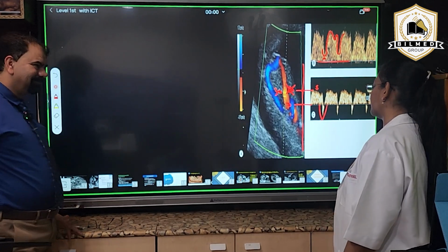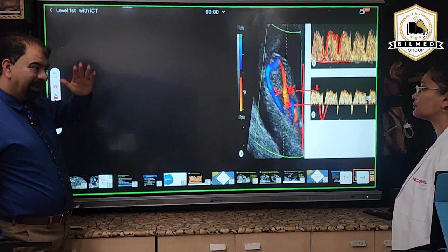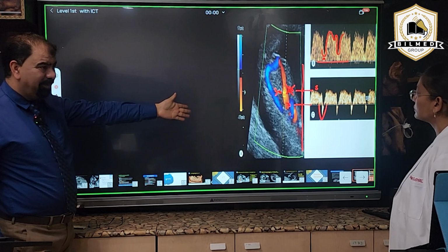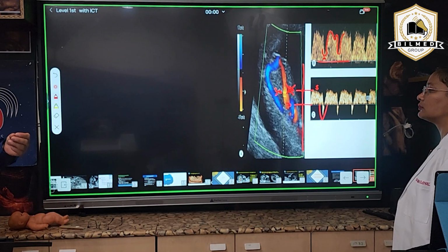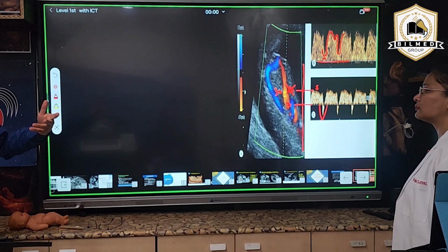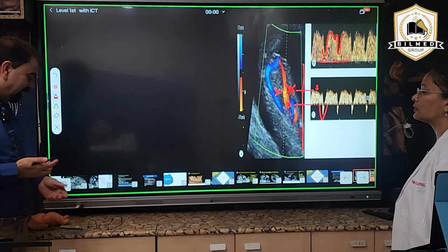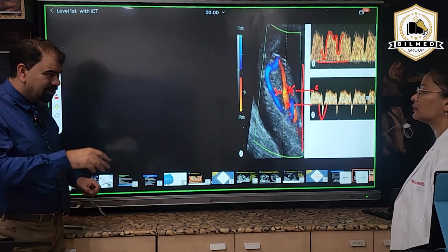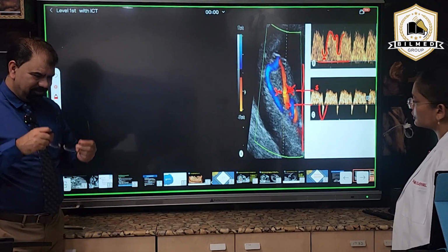Hepatic vein. So this is actually a hepatic vein which is already taken by that doctor for an abnormal ductus venosus. Now, have you not seen cases where it was written that abnormal ductus venosus and rest of vessels were normal? How is that possible? That fetus has landed into acidosis with no signs of hypoxia from other vessels.